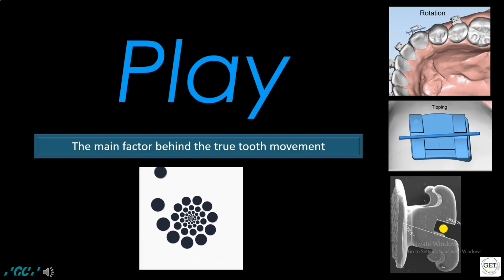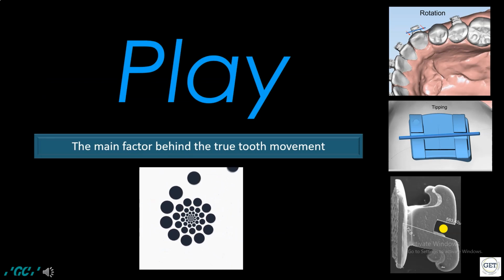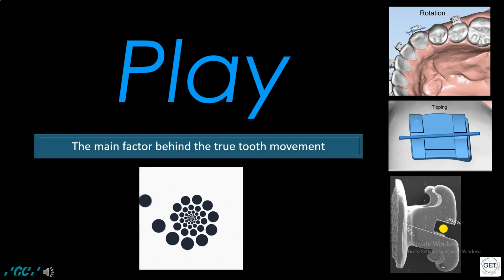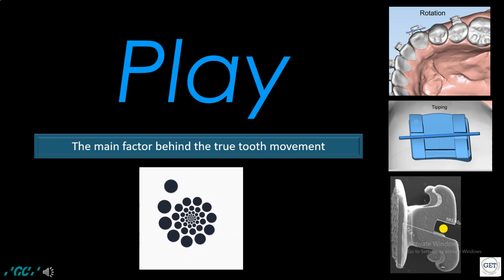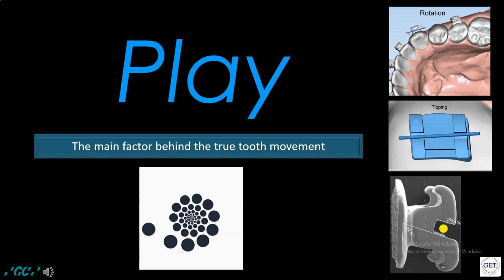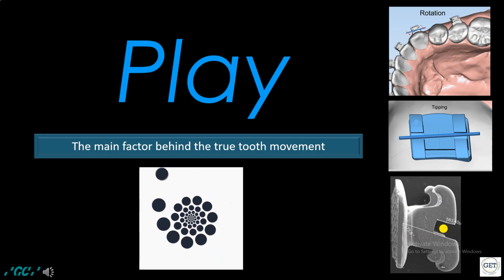Play is considered to be a major player in the control of the teeth movement, the expression of the system prescription, treatment time and outcome. It will be manifested in uncontrolled or undesired teeth movement, such as tipping, rotation, and torque loss. Good knowledge and special efforts are required from the doctor in order to overcome and control those side effects.